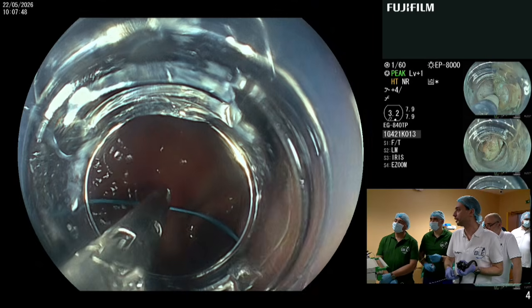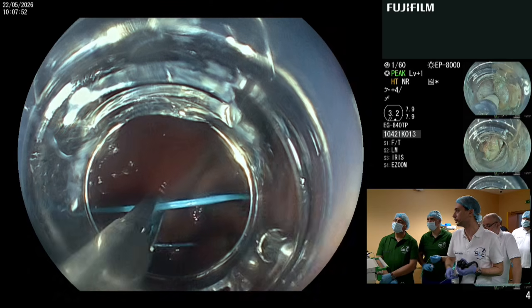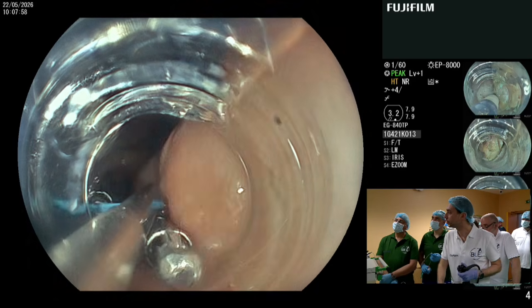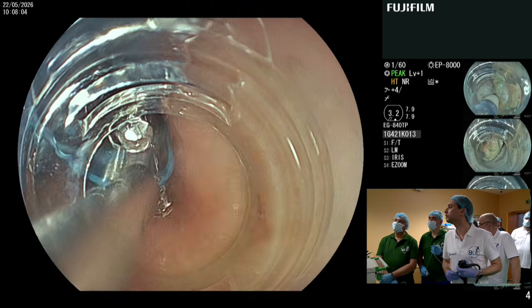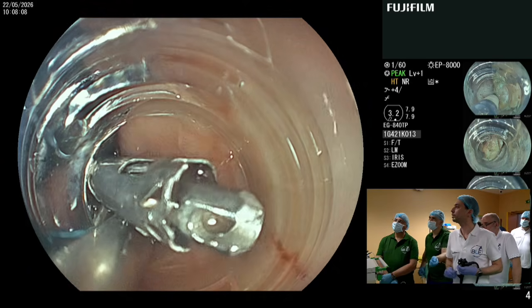Okay. Use the clip for traction. Yes, close. All right. We'll place this. Open. Close. Fire. All right. Next.